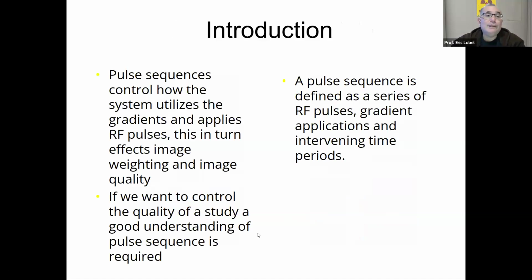So that's just it again, right? The pulse sequence diagram is going to show you when the gradient is applied. It's going to show you when RF is applied. It's going to show you the signal. And you should get to a point where you can look at a sequence diagram and understand what's happening, like be able to call it an incoherent gradient sequence. So again, it's something you kind of have to memorize, but this is also where clinic will help as well.